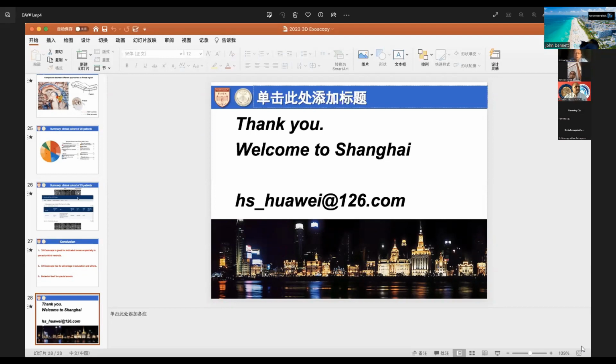Actually, in the microscope era, we used the microscope a lot in previous years. Recently, we used exoscopy and endoscopy a lot, but we have a lot of experience here in our department, in our team. We did a lot of pineal region tumor resection, but recently we summarized a lot, and according to our experience, we look at how the tumor invaded the third ventricle or the fourth ventricle, the two directions, because for the microscope, when you use the poppen approach, even if you cut the tentorium, if the tumor is huge, it will still be blocked by the vein system, and it's also difficult to pull the tumor out from the contralateral side.